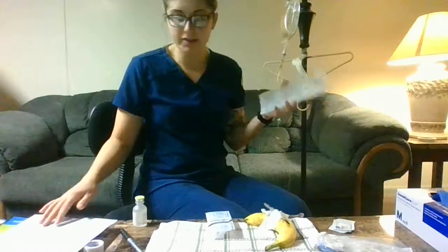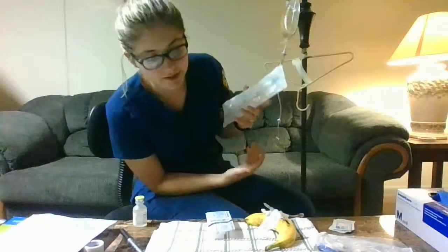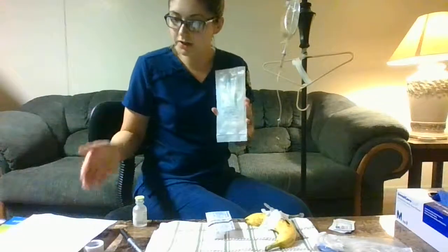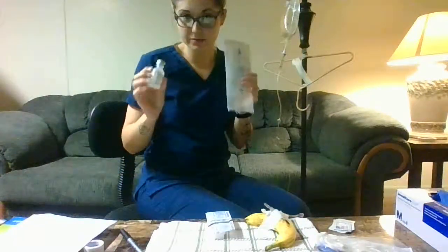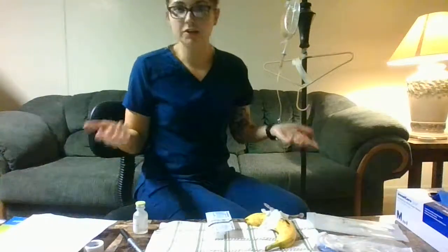So when we're doing all this, we're going to do the 3-check method. So our first check that we just did, the right patient, 2 patient identifiers, can I have your last name, date of birth. So we're doing that right now, making sure the order corresponds to the patient. And then we're going to do another check when we're getting our medications. And then that third check is at the patient bedside, where we want to do our 6 rights of medication administration again.